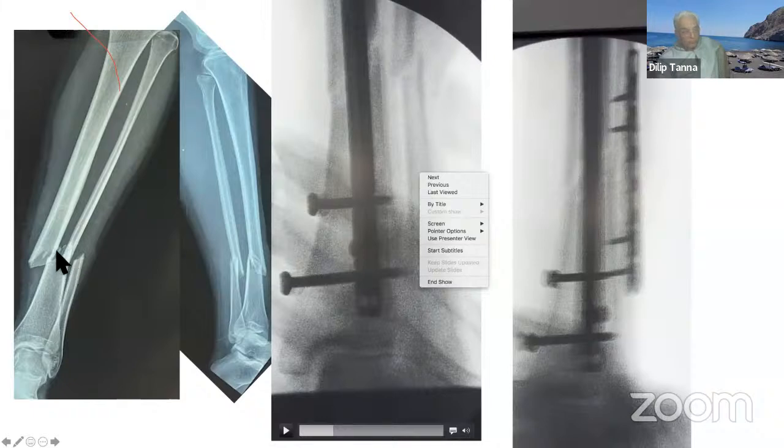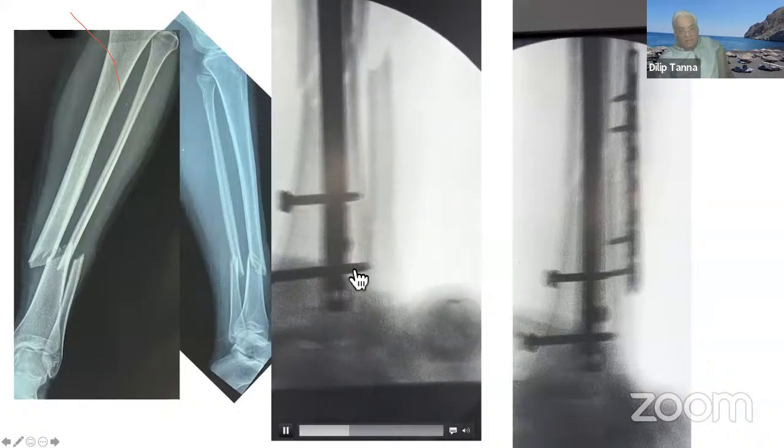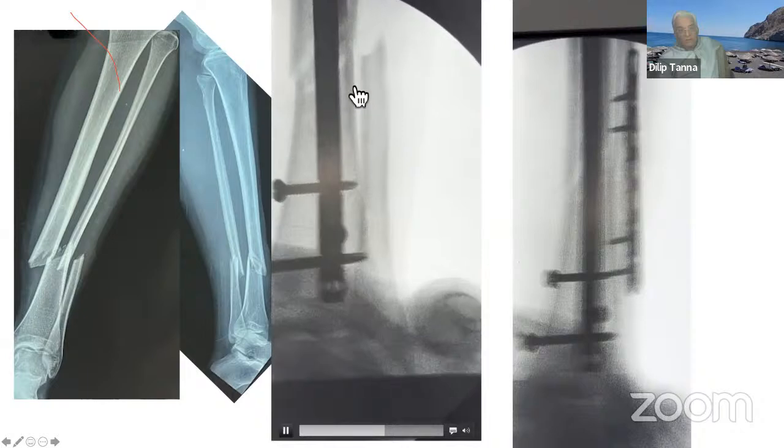Now here you see, I want to show this case. This is the oblique fracture. So I did the nailing. I did the nailing and I saw the nailing. You can see the movement.